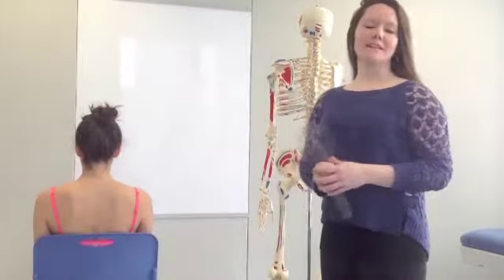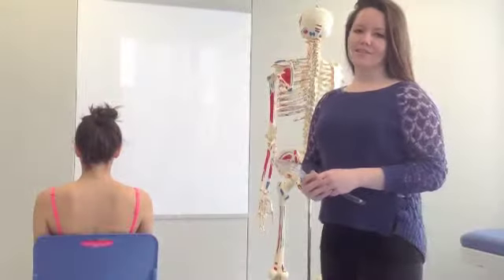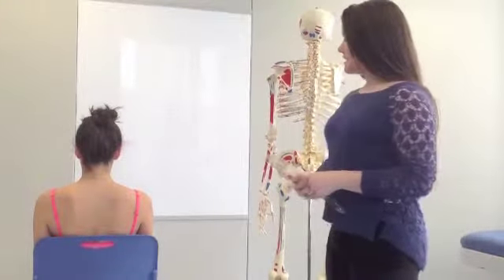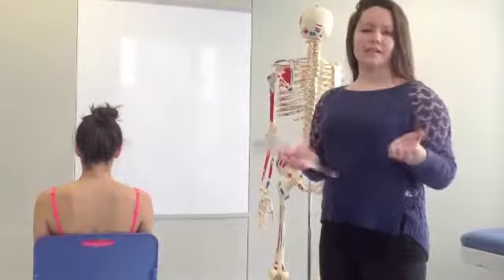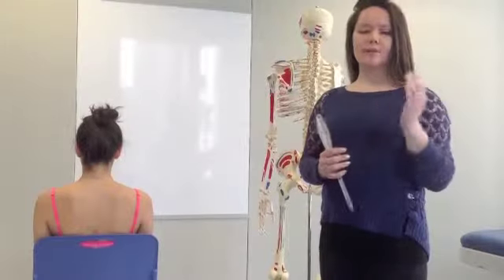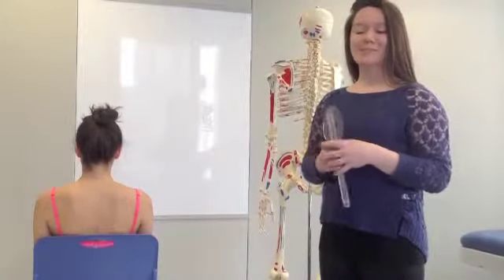Today we're going to be talking about how to measure cervical lateral flexion or side bending. The biomechanical rationale behind this is we're looking at the lateral range of motion of the upper and lower cervical spine combined.